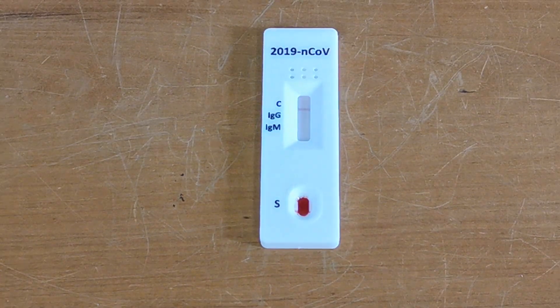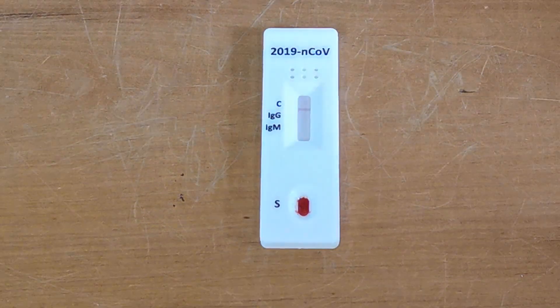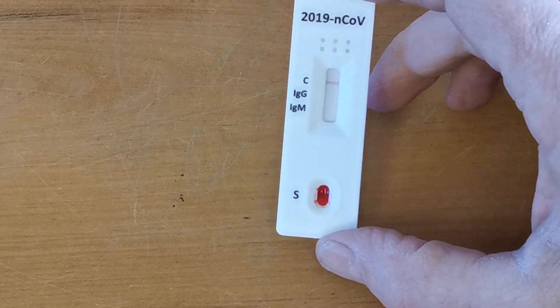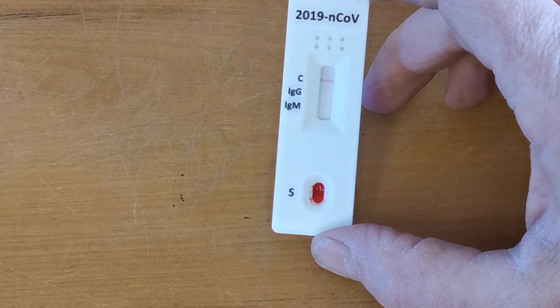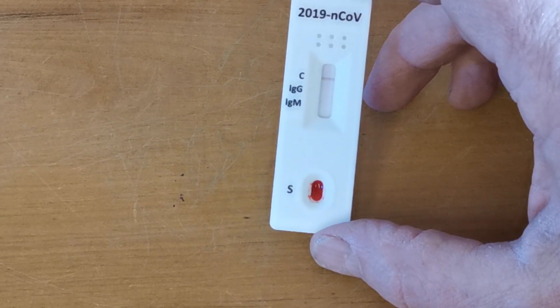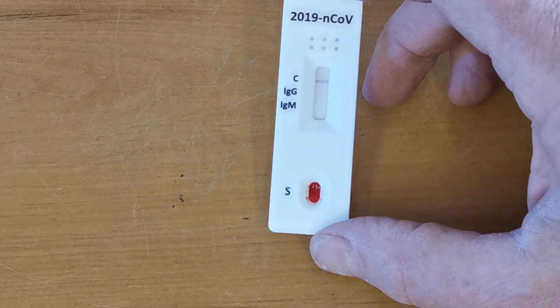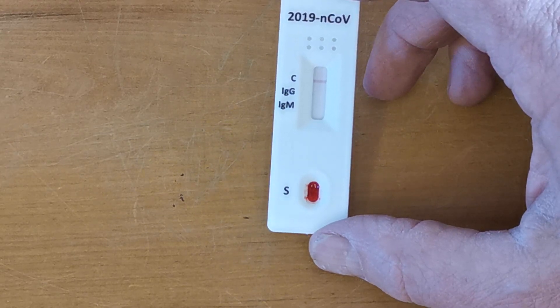Welcome back — this is now the 10-minute point and you can see clearly the results of this test are negative, with no T lines forming against the IgM and IgG segments of the results window, but with a nice clear control line showing that procedural samples have been added correctly. So this sample is negative for both IgG and IgM antibodies.